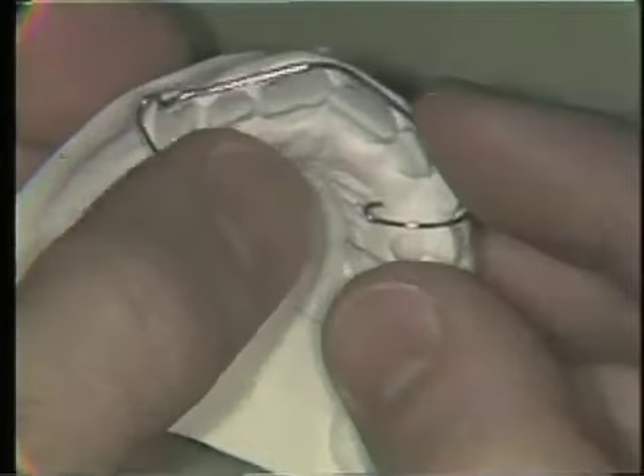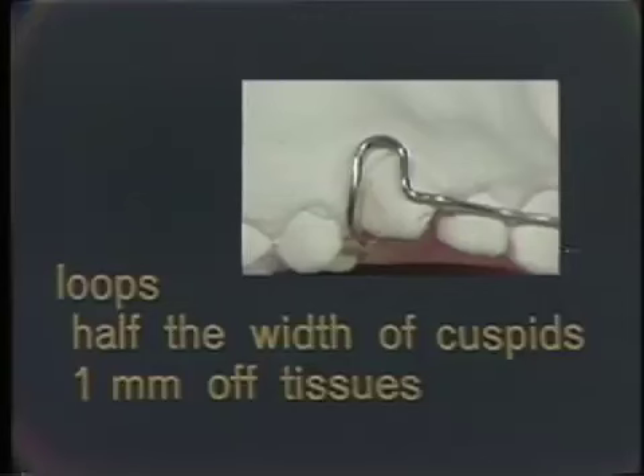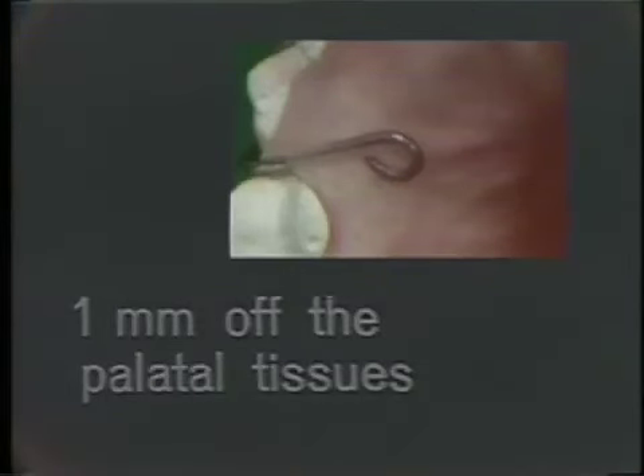The criteria for a good labial wire are: first, the wire must contact the middle one-third of the labial surface of the incisor teeth. Secondly, the loops must be half the width of the cuspid and they must be one millimeter off the gingival tissues. The wire must be closely adapted to the work model as it crosses the occlusion. And lastly, the wire must be one millimeter off the palatal tissues.